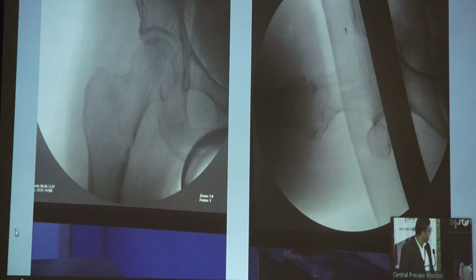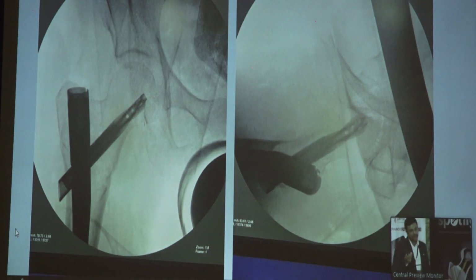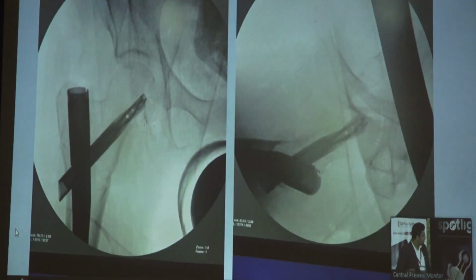We ended up doing this case also because Dr. Desai also said we are worried for the osteoporosis, so I had not used cement till now, but I also like to put the screw in osteoporotic fracture little on the inferior side, but now I'll try for cement and maybe then I'll put center.